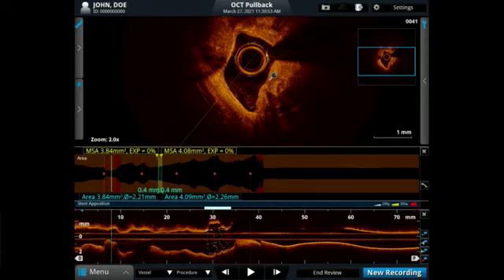I think there is calcium extending from the distal edge of the stent. It's behind the stent, and then it seems to be sort of growing into the lumen beyond the stent. It would be interesting to see what the Shockwave does to the nodule. Yeah, that'd be the nice way to start. Sure. Yeah, let's have a look, and perhaps give quite a lot of the shocks to that region. Perfect. So we can start with them.